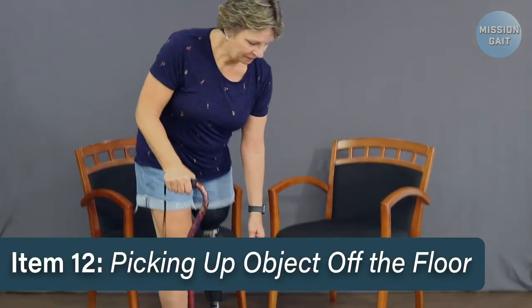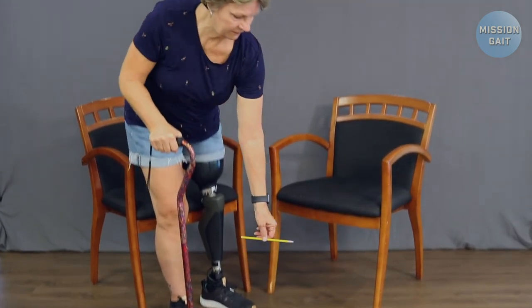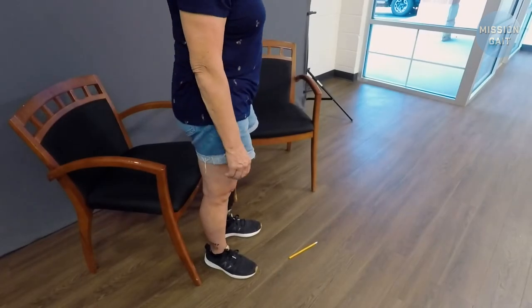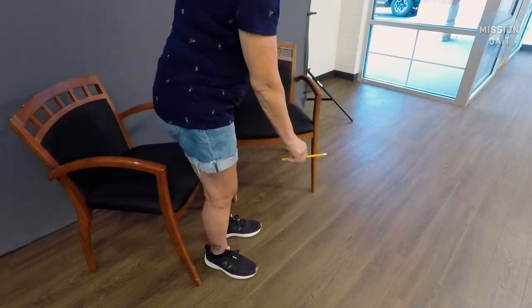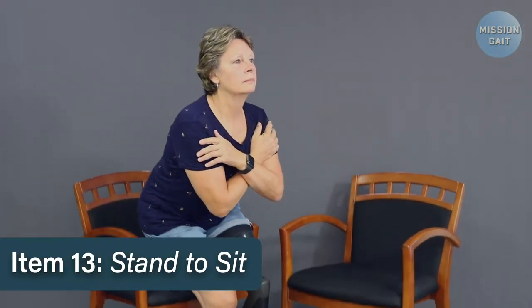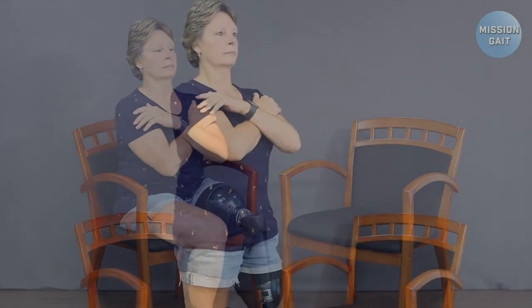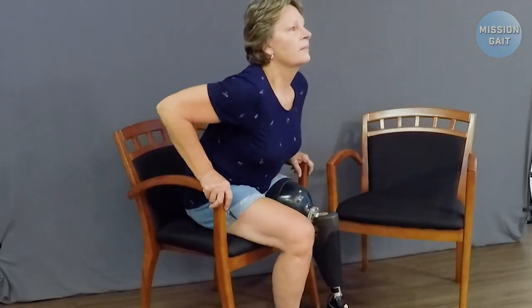Item twelve, picking up object off the floor. Place a pencil on the ground at the patient's midline, 12 inches in front of the foot. Have the patient pick up the pencil and return to standing. Item thirteen, stand to sit. Have the patient fold their arms across their chest and sit, using arms or assistive device as necessary.